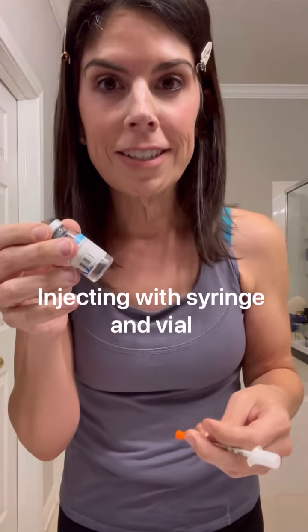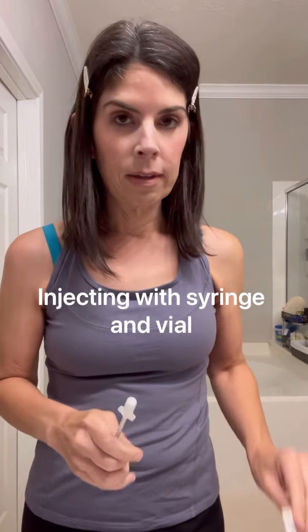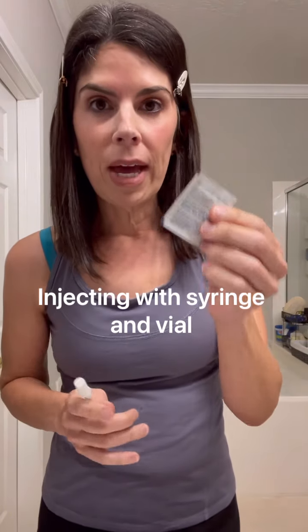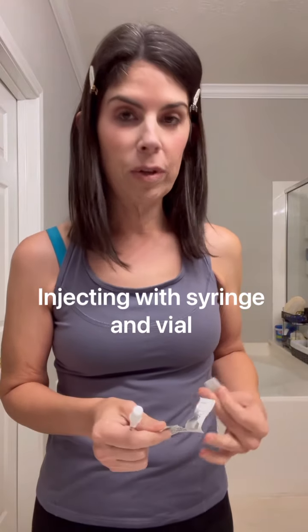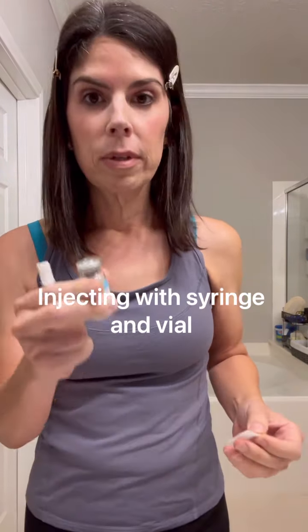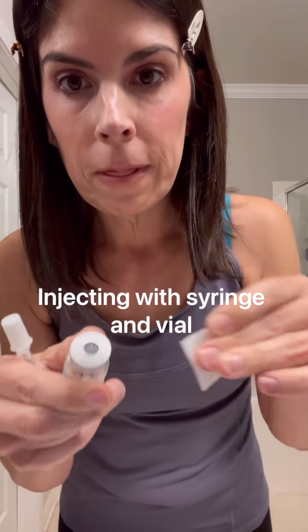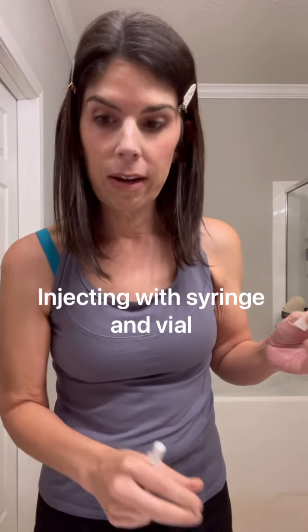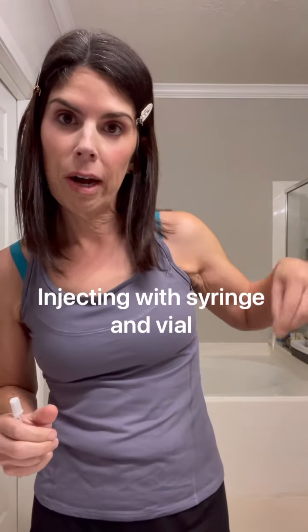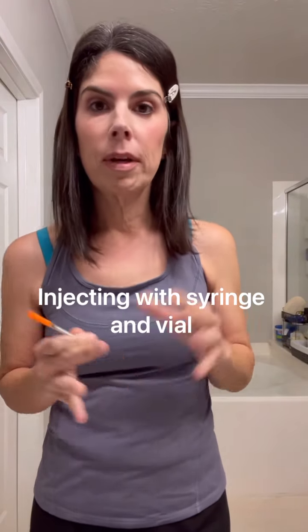Get your alcohol pads — you'll need two for this. The first thing you're going to do is wipe the top of the vial, put it back down, and let it dry. Throw that alcohol pad in the trash.